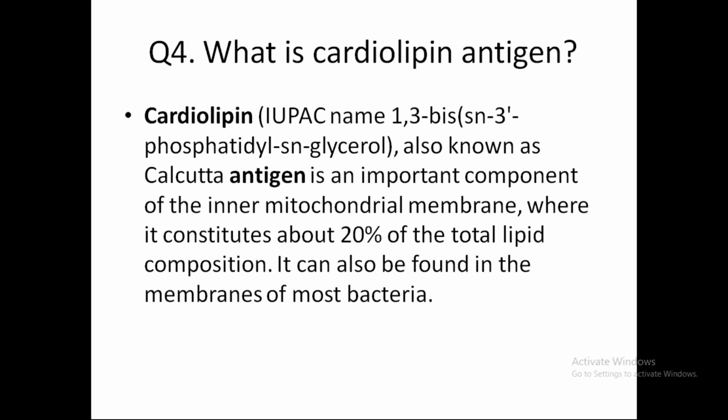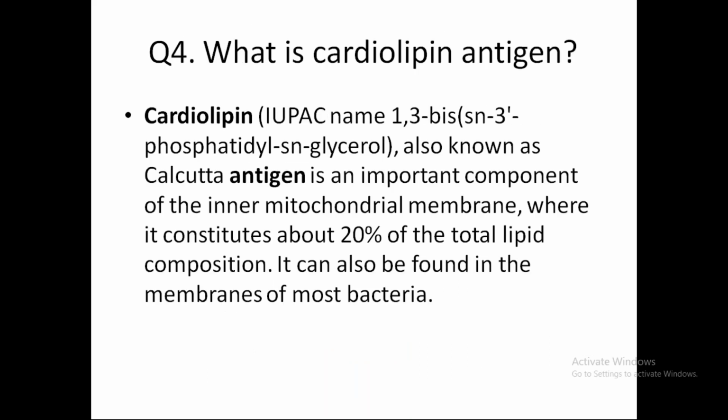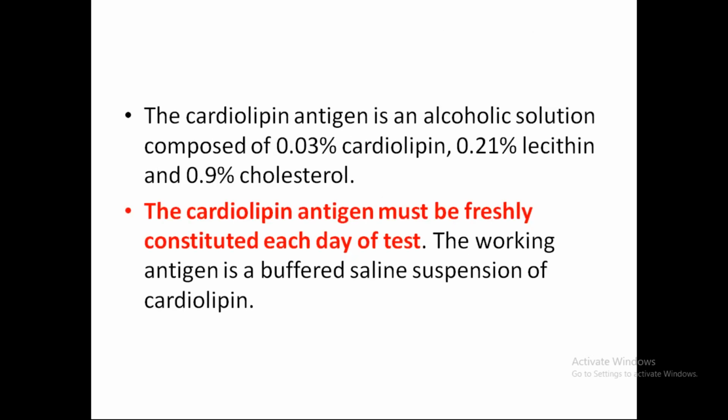Then, why is this test known as non-specific test? We are using cardiolipin, right? It is mainly known as non-specific test because it is a lipoidal extract from beef heart. So this antigen is usually extracted from beef heart, but not from Syphilis, Treponema bacteria. That is why it is known as non-specific.